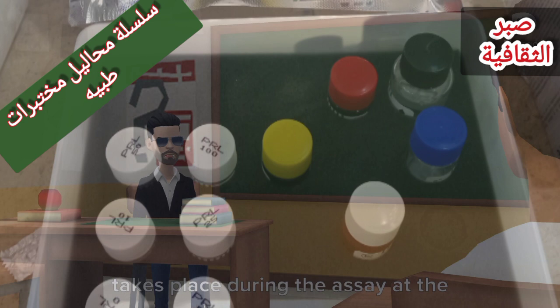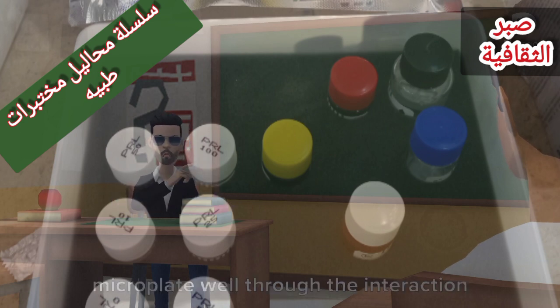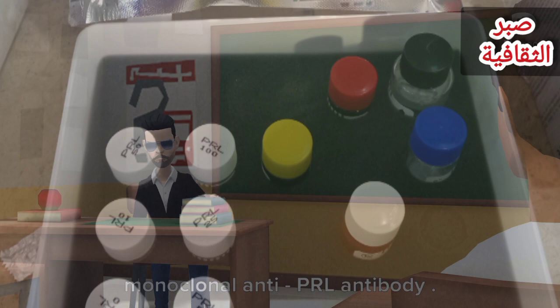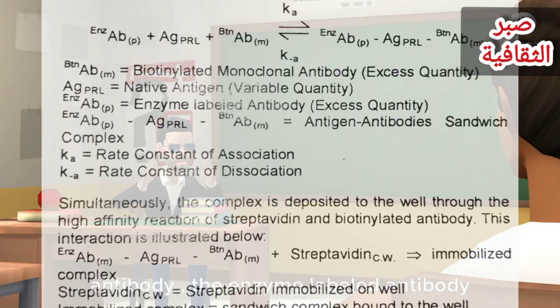In this procedure, the immobilization takes place during the assay at the surface of the microplate well through the interaction of streptavidin coated on the well and exogenously added biotinylated monoclonal anti-PRL antibody. Upon mixing monoclonal biotinylated antibody, the enzyme-labeled antibody and a serum containing the native antigen, reaction results between the native antigen and the antibodies, without competition or steric hindrance, to form a soluble sandwich complex.